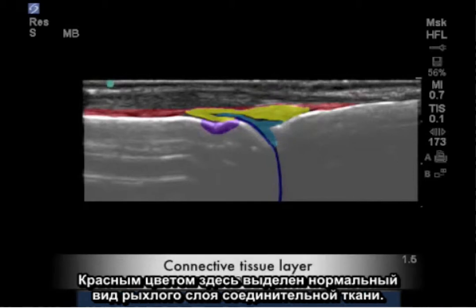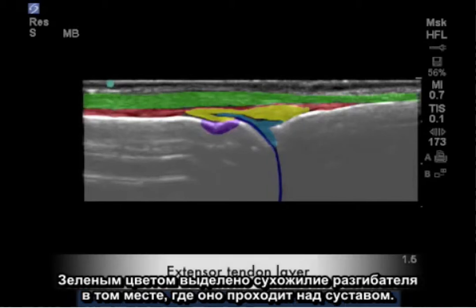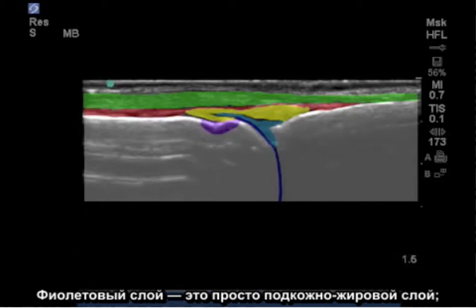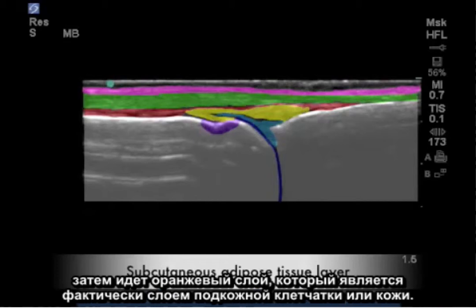In red, we see highlighted here a normal appearing areolar connective tissue layer. In green, highlighted is the extensor tendon as it passes over the joint. The purple layer is simply a subcutaneous fat layer, followed by the orange layer, which is the actual cutaneous layer, or skin.